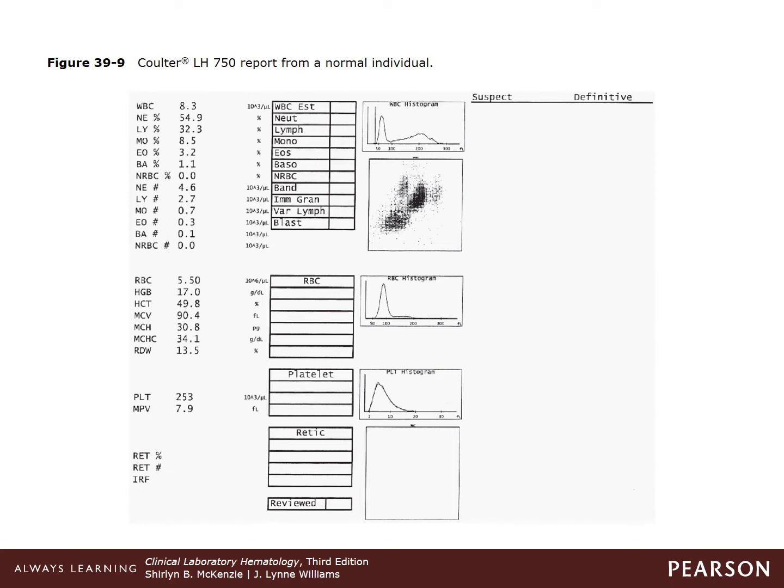Okay, so any particle or cell of more than 36 femtoliters is counted as a red blood cell. Because these apertures are located within the chamber, there are 3 different counts obtained. If these counts compare, then the system will report out a red blood cell count. This will produce a red cell histogram, which is a size distribution curve. It's created based on the cell volume and cell number.